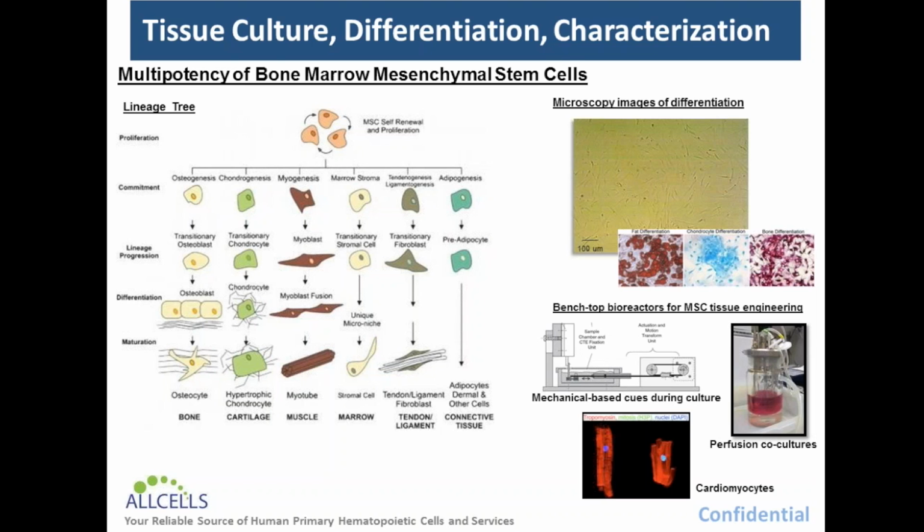This is often performed in a bioreactor setup with a tissue scaffold that can provide structural support for differentiation. Also pictured is a perfusion culture used in tissue engineering. Constant media replenishment is achieved, as well as specific shearing forces, which helps the growing tissue achieve the correct morphology and physical properties.